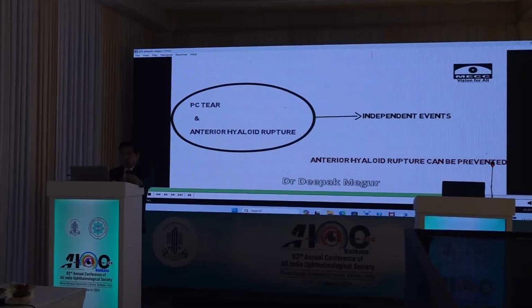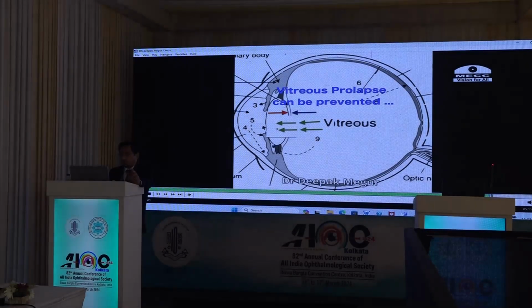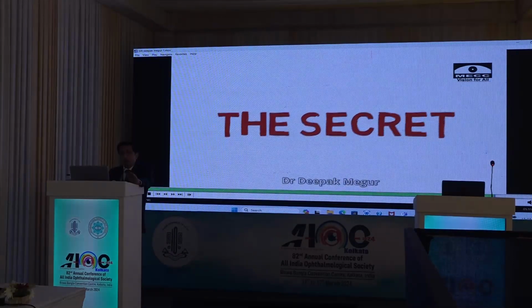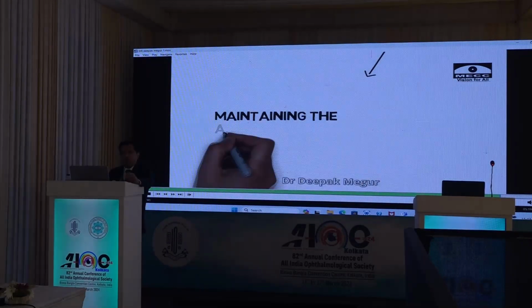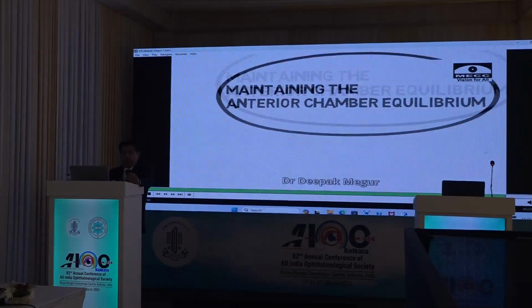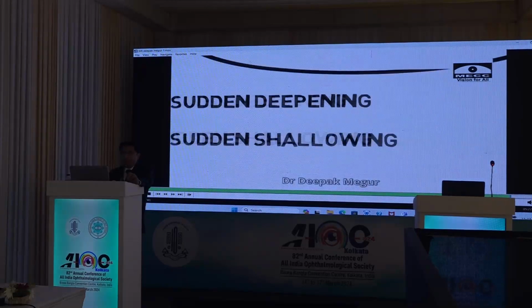So what do you do to achieve this? How can we, apart from diagnosing it early? So probably the most important thing is always, the secret is you have to maintain the chamber. The secret is in the chamber. So never allow the chamber to either suddenly deepen or suddenly shallow. Both are equivalent. The secret is equilibrium has to be maintained. So prevent sudden deepening and sudden shallowing.